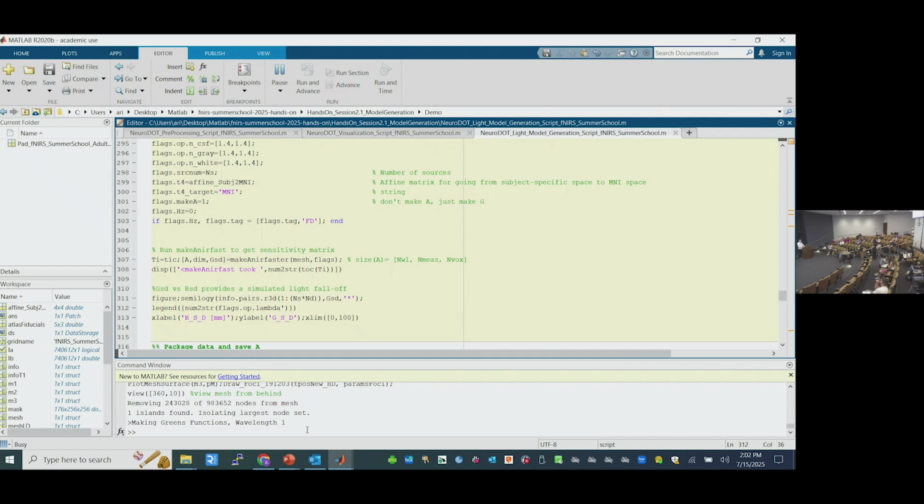While we have time, in the PowerPoints, is it obvious what we change for our own data versus what we keep, because that's the toolbox? Let's say we want to go home tonight and do this on our own data. Yeah. So in terms of the steps, everything will be the same unless you're splitting the pad up. In terms of what's different, it really depends on two things.